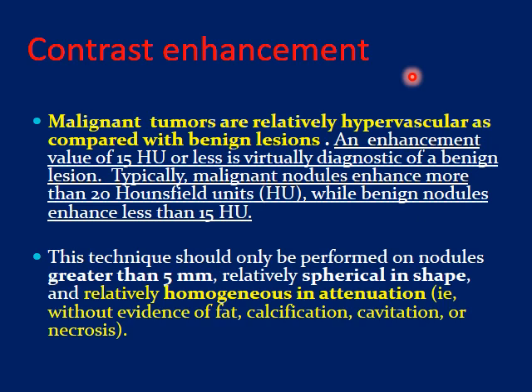To assess contrast enhancement within a lesion, you should do pre-contrast and then post-contrast. But actually, what we do in our daily practice, we go for post-contrast CT of the chest immediately, and we don't do CT of the chest pre and post-contrast for fear of radiation exposure. But if you want to measure contrast in a lesion, you should have a pre-contrast, you measure the attenuation, then you measure the attenuation after contrast administration.